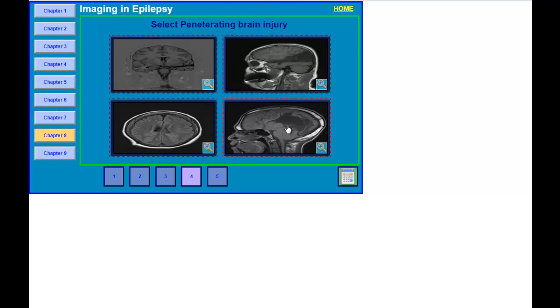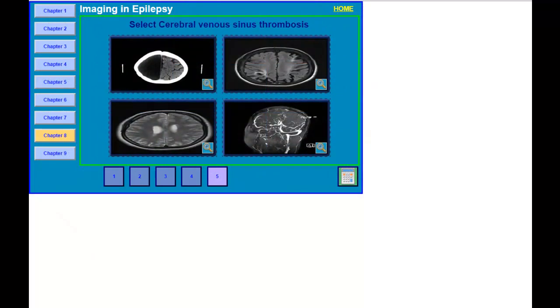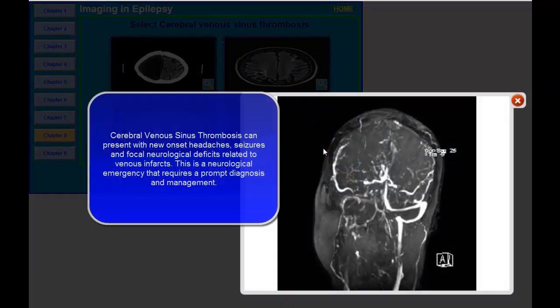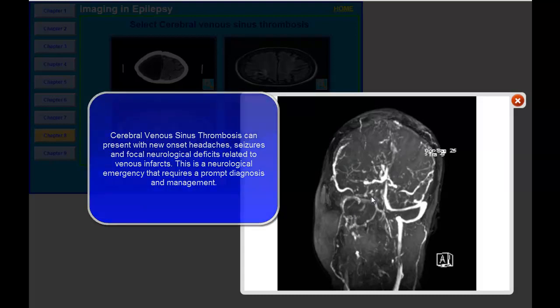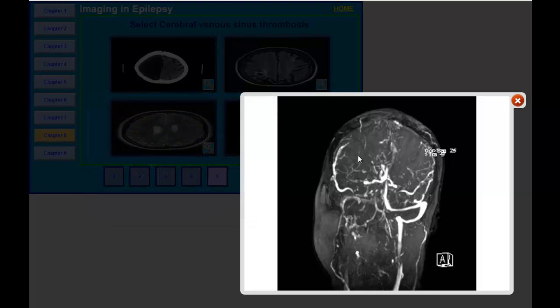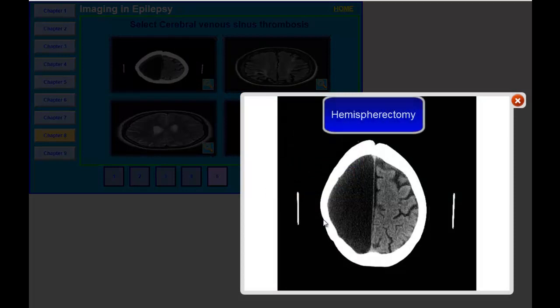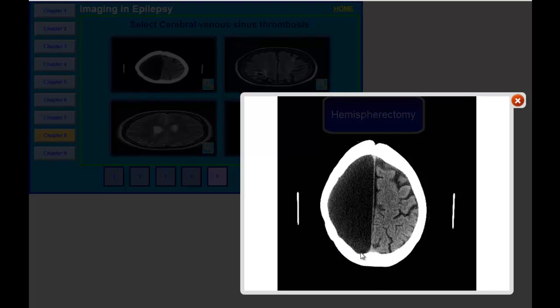The correct answer is select penetrating brain injury. The next question is to select cerebral venous sinus thrombosis. On this MR venogram, you can see the sinuses are fine on one side, but the sinuses don't show up on the other side — this person has a venous sinus thrombosis, which is why you're not able to see the contrast on the right side. The other image shows a patient who had a hemispherectomy — the whole hemisphere was surgically removed because this patient was having almost continuous daily seizures not responding to medications.